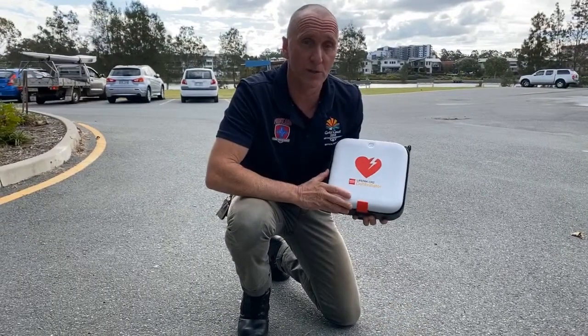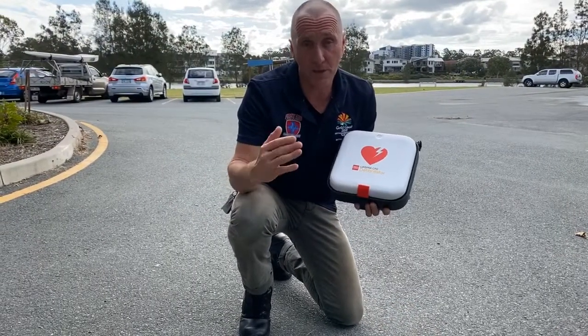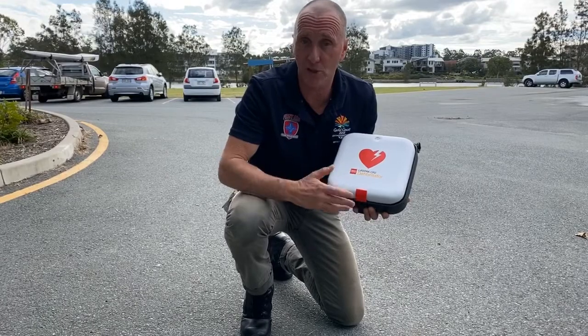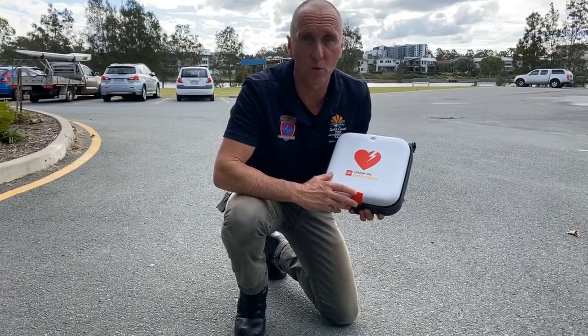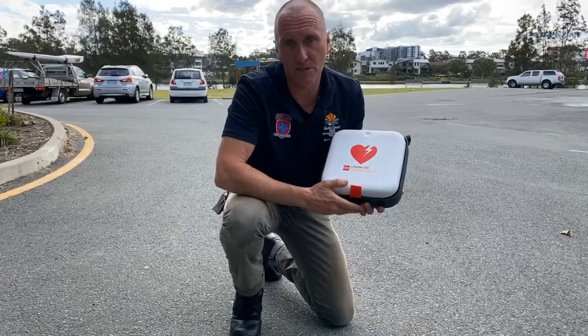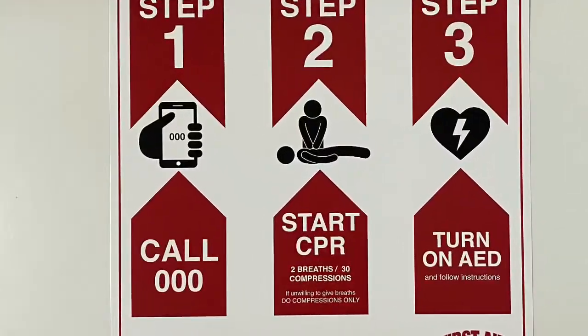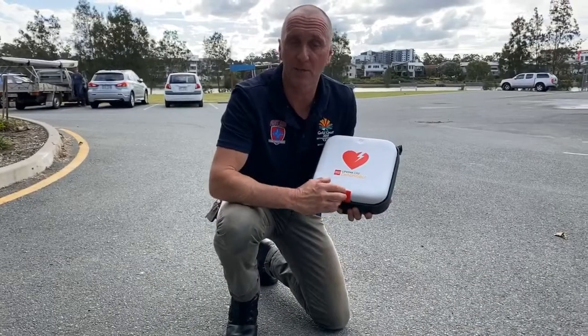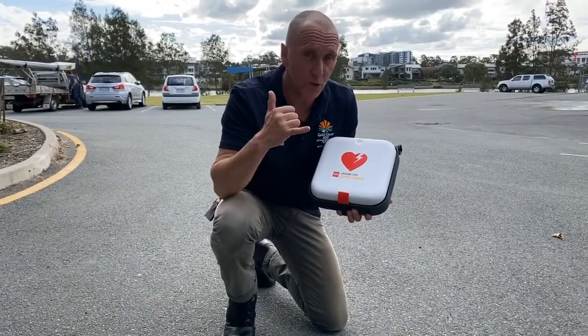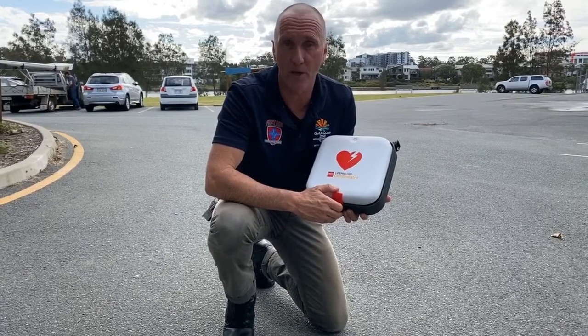Using the CR2 defibrillator is three simple steps called the chain of survival. The first step is calling emergency services as quickly as possible, using the Emergency Plus app because that locates you and lets emergency services know where you are.